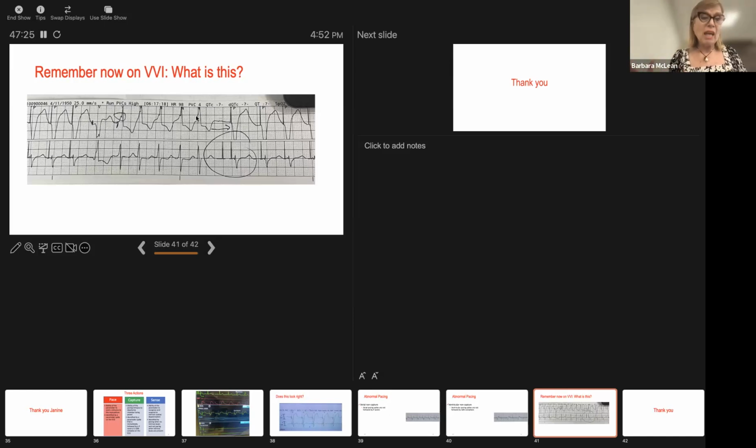This is a failure. There's a failure with your pacemaker. And then you have a pause, and then you fire your pacemaker again. So I'm looking at that pause, I'm looking at that fusion, and then I look, this is my lead 2. Now I look down here at my V lead. What is that? That really concerns me.